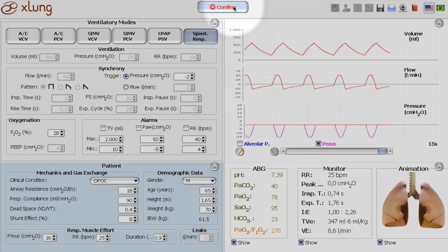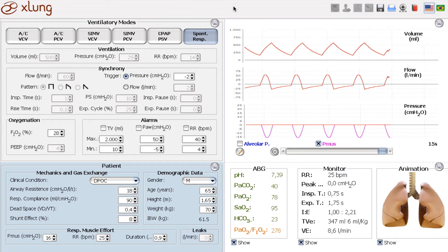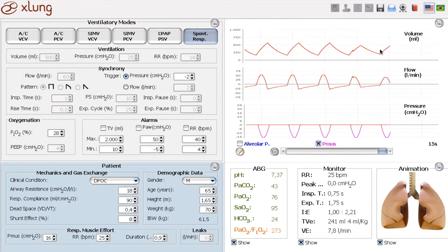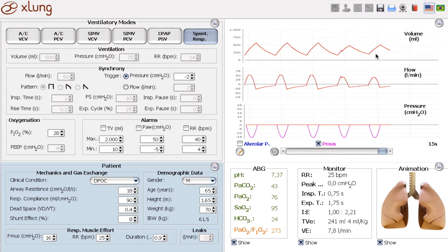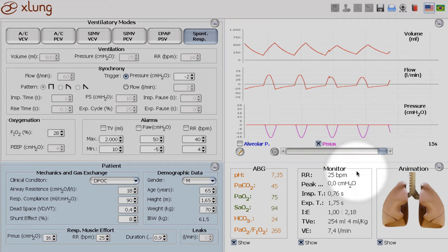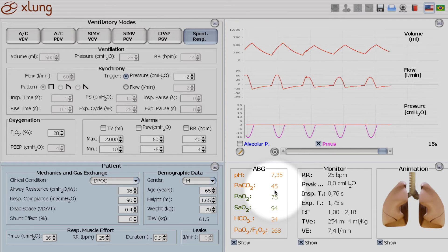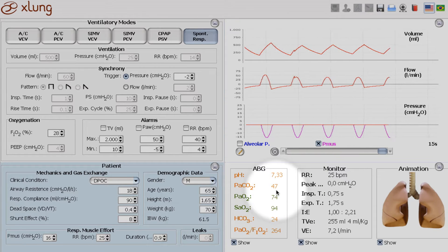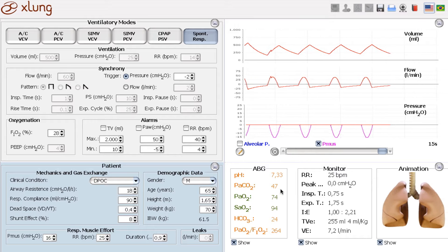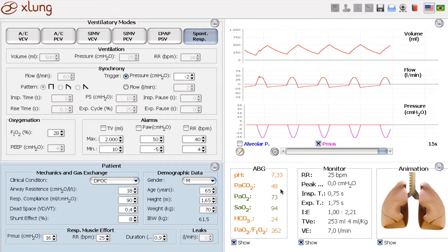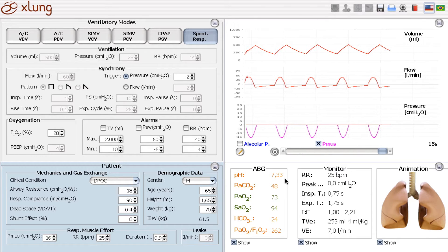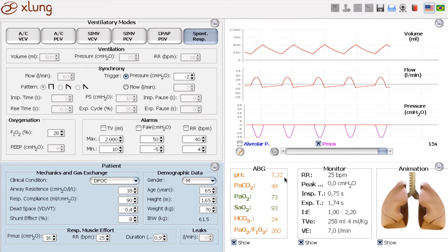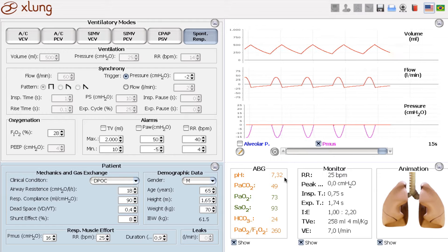We confirm this alteration. And look at the tidal volume. Now it's reduced. And most important, the arterial blood gases show retention of CO2 with acute respiratory acidosis.